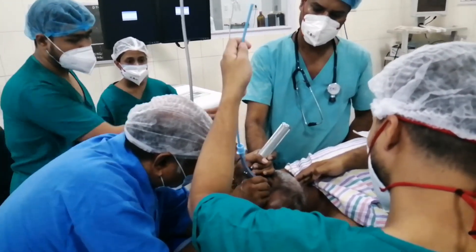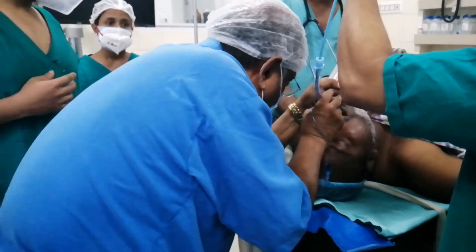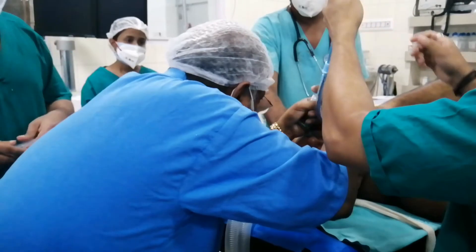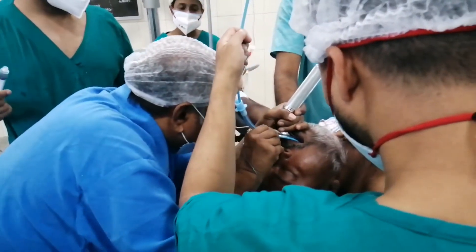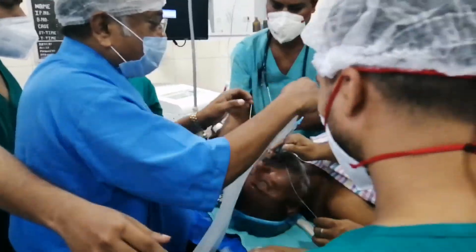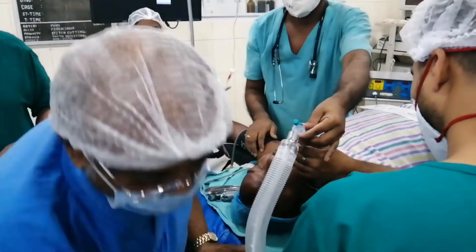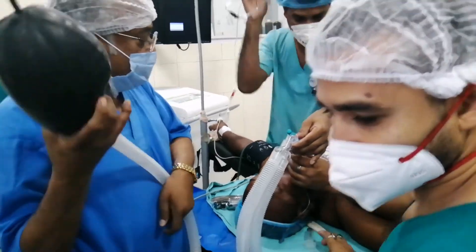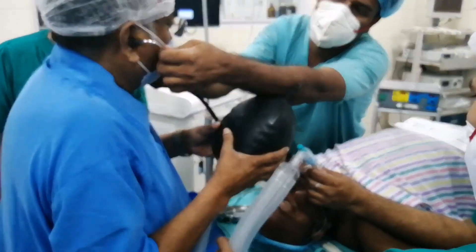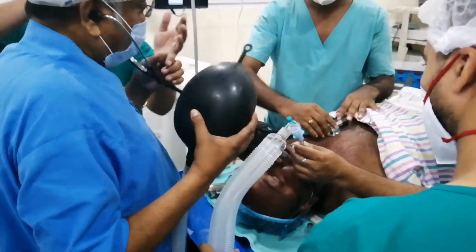After visualization of the vocal cords, Dr. Naha pushes in the endotracheal tube through the vocal cords into the trachea. He now fixes the tube well so that it doesn't come out of the trachea, and checks both the lungs for equal air entry.